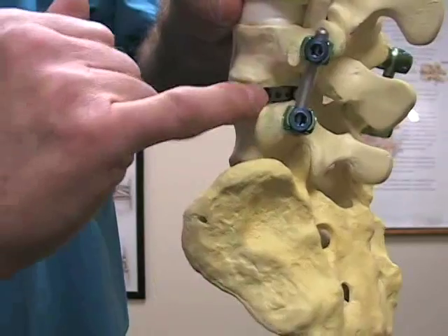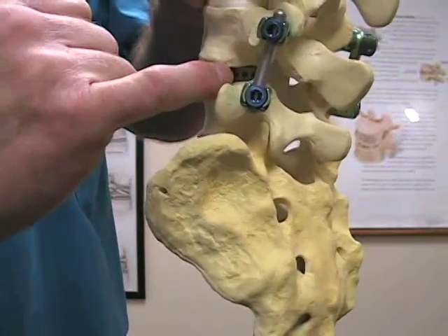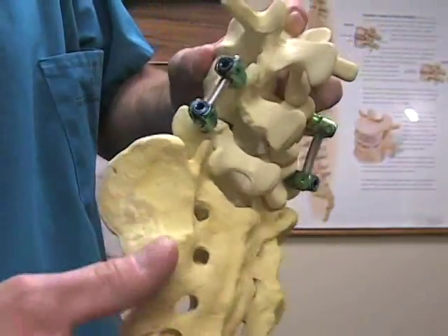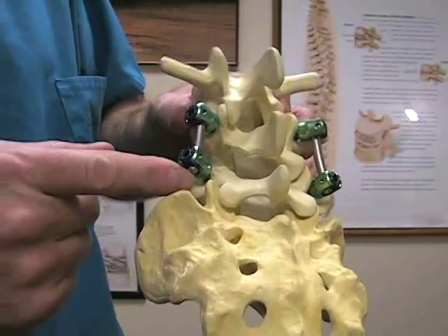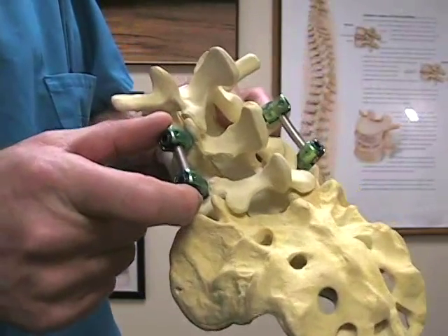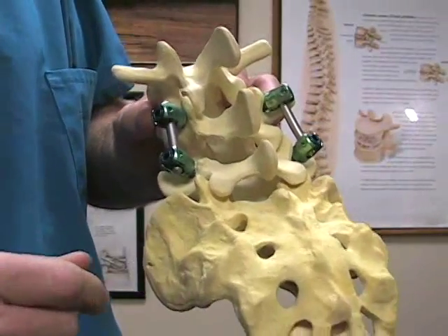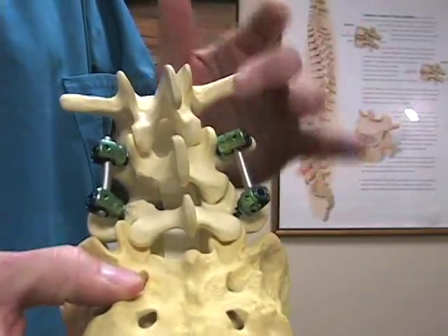But inside the disc space, after we take the disc out, we have that little plastic implant that we put in there with the Infuse, and then packing additional bone inside there. And then we'll often supplement with these pedicle screws. Now, if someone has normal alignment of the spine and not any instability, then sometimes we'll just put the pedicle screws in on one side and not put them in on the other side. If someone has any instability issues, then we'll put the pedicle screws and rods on both sides.